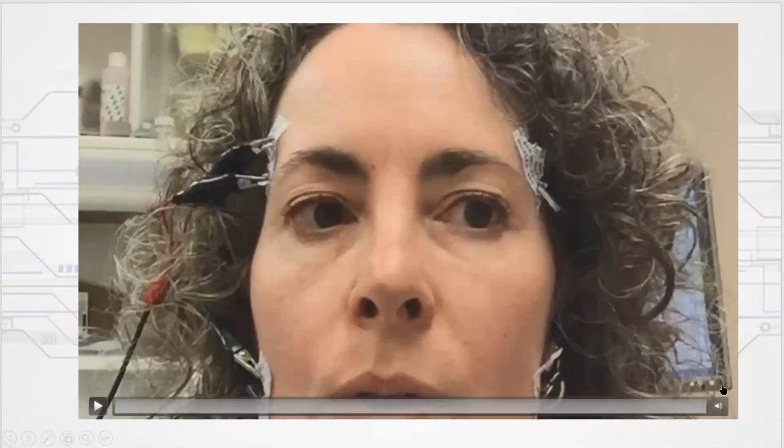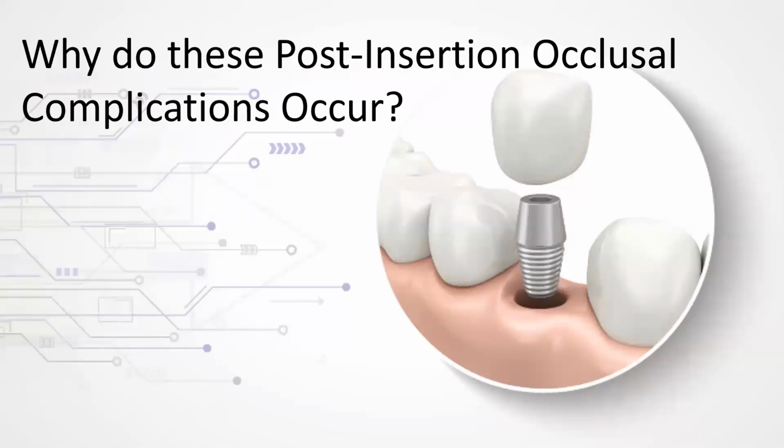I just want to point out she's wearing EMG leads. One of the great things the T-scan does is it synchronizes with electromyography software, which is really an incredible combination. But the treatment that she received was based in the T-scan. The occlusal treatment was rendered by the T-scan, and her muscles were measured before and after treatment as part of her therapy. So the question becomes, why do these post-insertion occlusal complications occur?